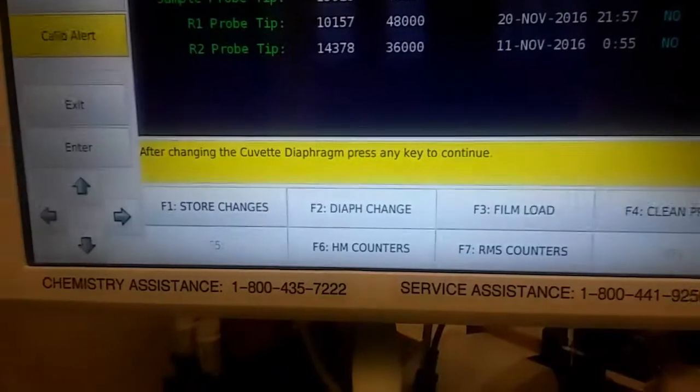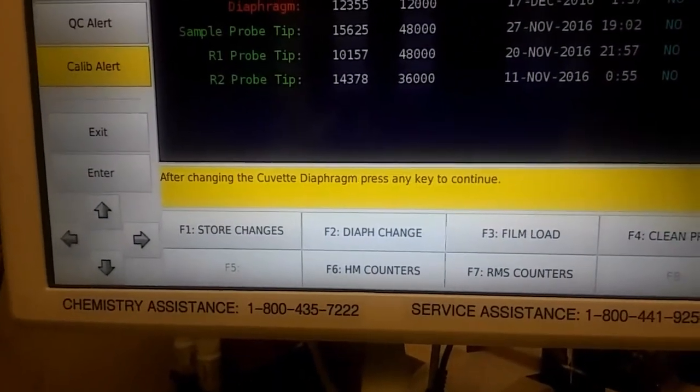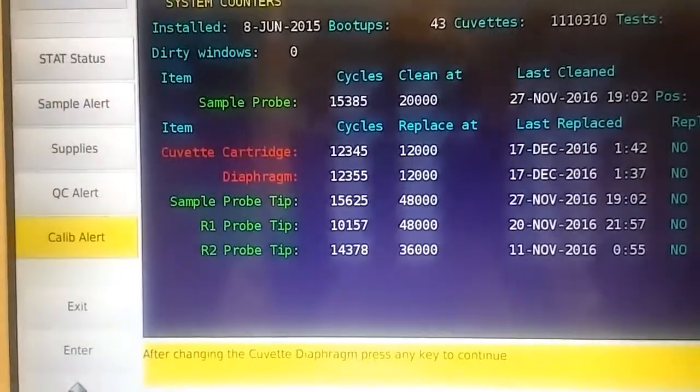Once you're going to change the diaphragm, you will hit diaphragm change which is F2. It says after changing the cuvette diaphragm, press any key to continue, and that will reset the counters to zero.